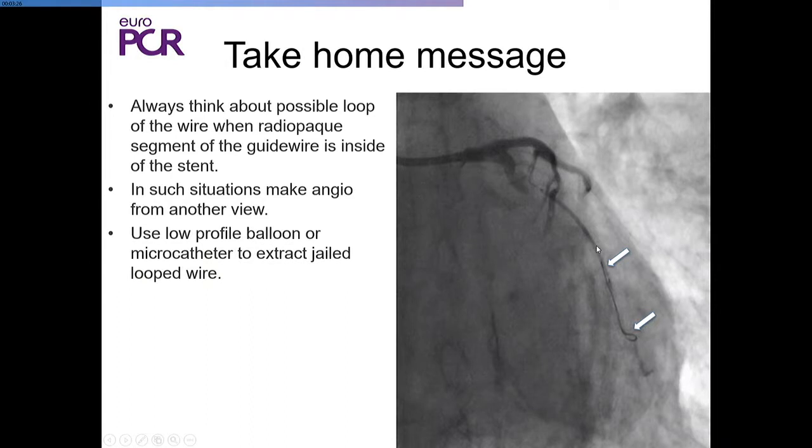Do you have any questions? Any questions or comments from the floor? Has anybody experienced something similar with this side branch wire? I suppose this isn't really the side branch, it's the buddy wire getting stuck. Anybody experience anything similar, and offer some solutions?